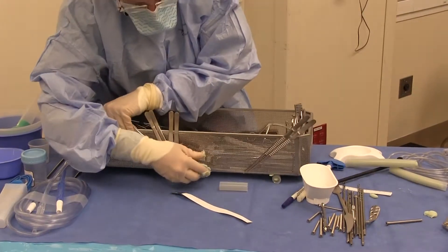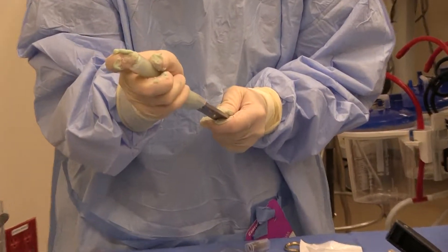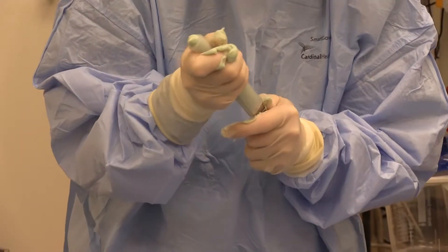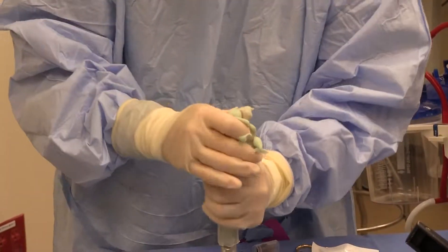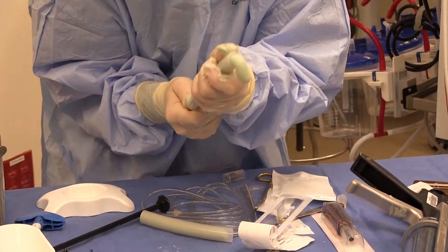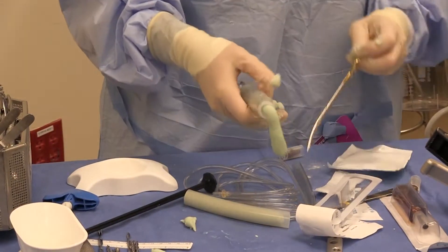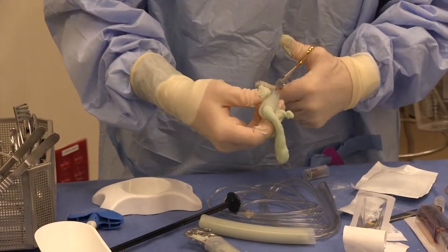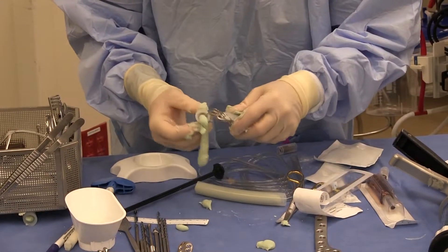Next, I'll put this underneath here — here comes the next plate. This plate is huge, and of course I'm not going to be able to put the bottom part into the plate, so we'll have to fool around with that, but I'll do my best to get a nice, even coating on the top part. The top part is coated, and then I'll cut this to help myself on the bottom here.